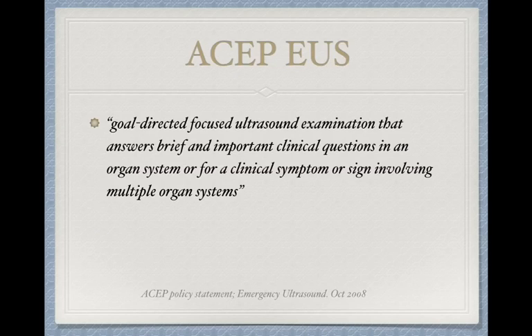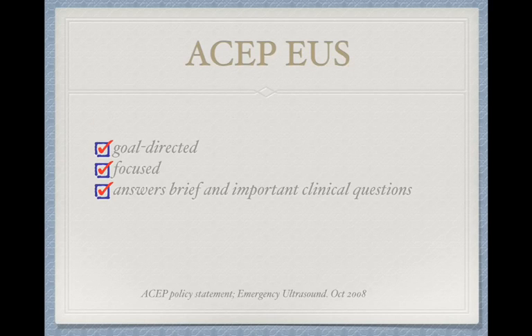So just a quick note on the goals of our bedside clinical ultrasound, limited ultrasound, whatever you decide to call it. What's important to understand with this is that we're not radiologists, we're clinicians. We're using ultrasound to answer brief and important clinical questions. We want them to be goal-directed, focused, and really the purpose of the ultrasound is to help us take better care of our patients and treat them with the right medicines and also guide us to the right diagnosis.